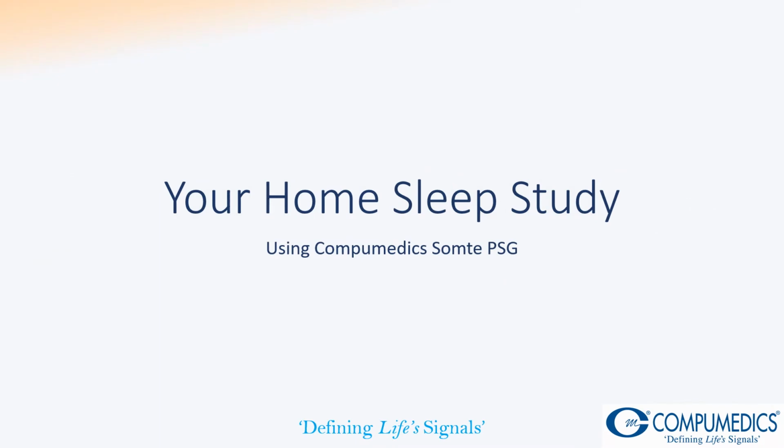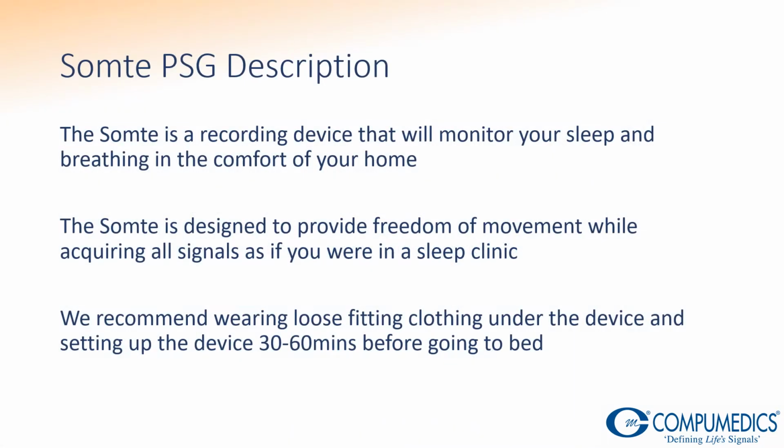This guide is to assist you with your home sleep study using the Compumedics Somte PSG system. The Somte is a recording device that will monitor your sleep and breathing in the comfort of your home. The Somte is designed to provide freedom of movement while acquiring all signals as if you were in a sleep clinic. We recommend wearing loose-fitting clothing under the device and setting up the unit 30 to 60 minutes before going to bed.